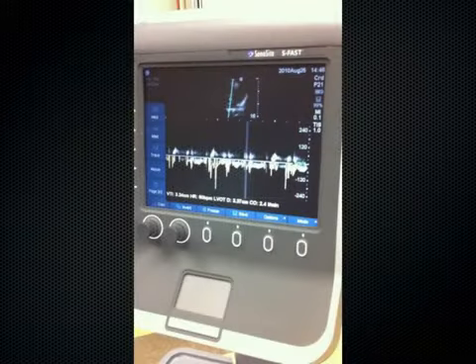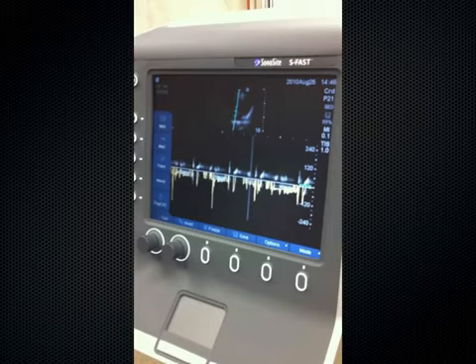Yes? So you have parabolic flow coming out, so when you do the gating, how large can you take the gate? Because depending on where you are, you're going to have completely skewed. Yeah, so there's a sampling gate that you can make wider or skinnier, okay? And that's a good question. I've been messing with that sampling gate. What he's asking about, that little TIE fighter, you can spread out its wings, if you will, further apart or more narrow, and that changes your waveform quite a bit. So that's something we got to mess around with. I'm not sure. This is all brand new stuff, so I don't know the exact answer to your question.